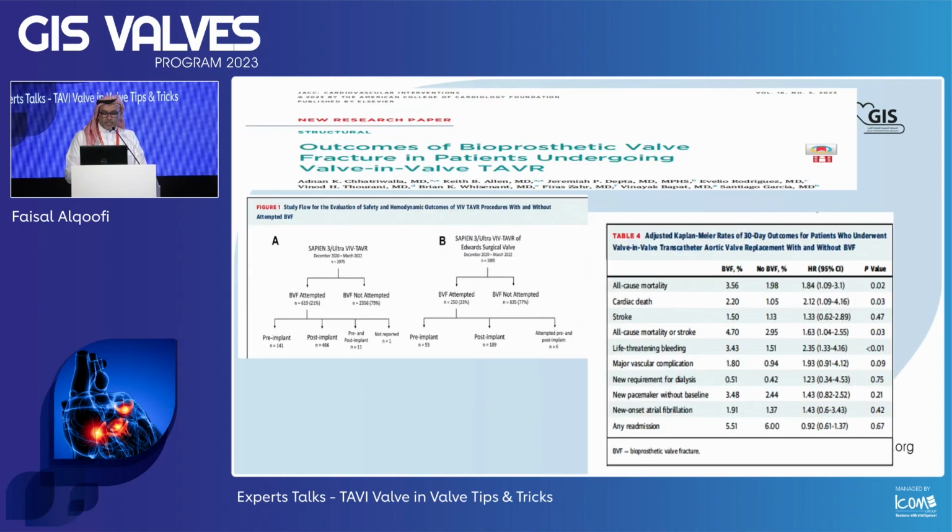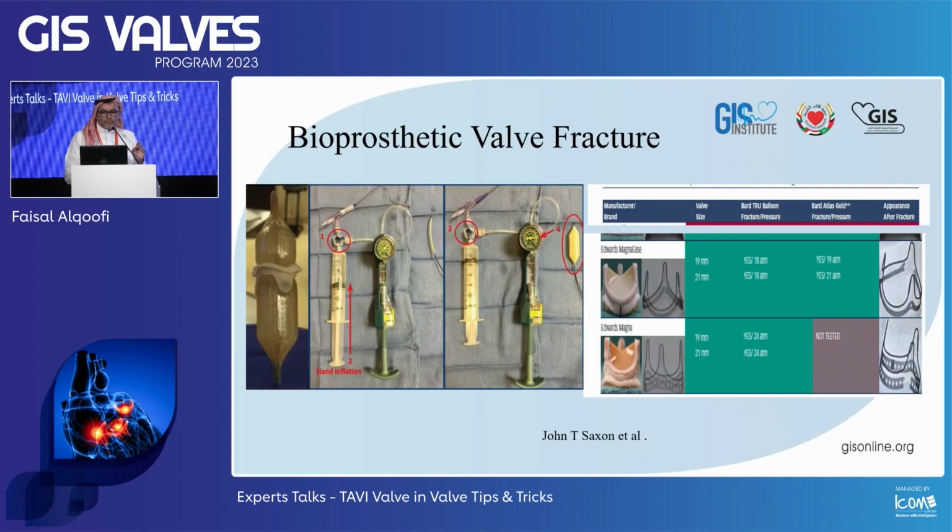And in general, we'll share 3 slides. One about the setup for a fracture. I think this is clearly available, you could definitely find it in this reference, but having a setup for basically a high pressure balloon, in addition to a high pressure syringe, in addition to an inflator. There is also a setup for the atmosphere. To be fair, we already passed 20 atmospheres in our valve, and then when it fractures, it is supposed to fracture at 19.